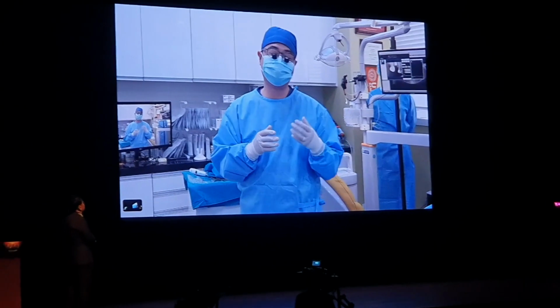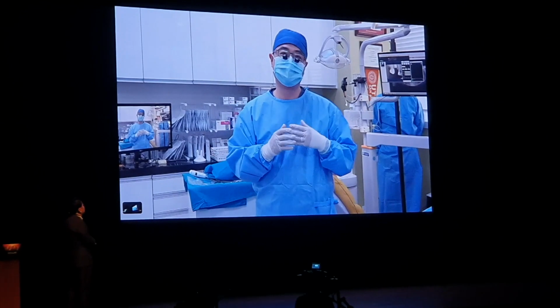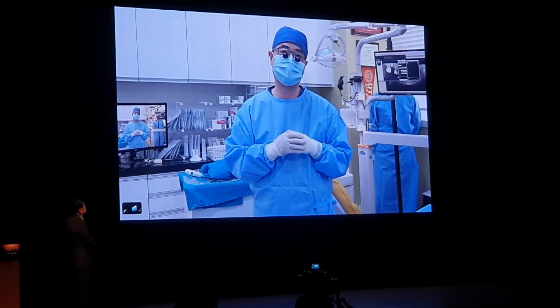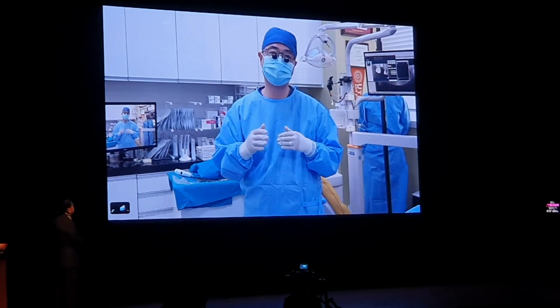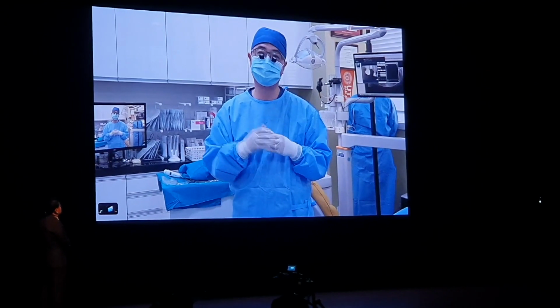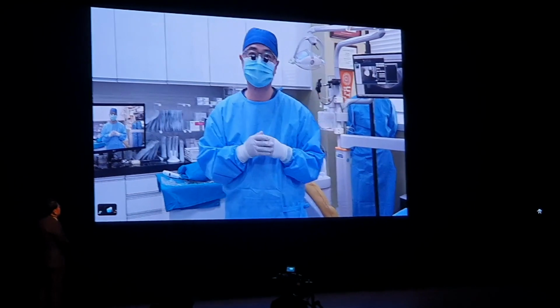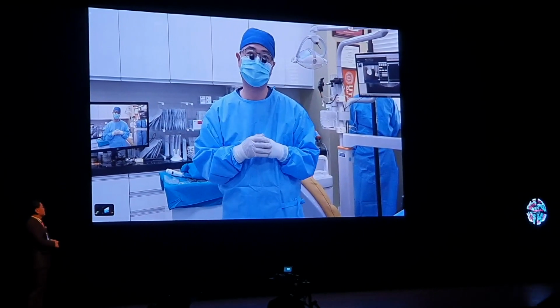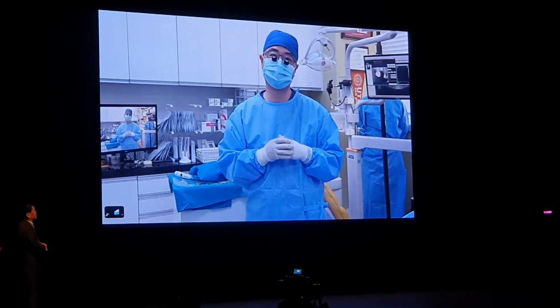Until yesterday, our original plan was only up to placing an implant. However, this morning Dr. Ho told me that he would want immediate loading if he achieved an initial torque value of 40 to 50 Newton centimeter. And here I have the intraoral scanner ready, so we'll show you that if time allows.